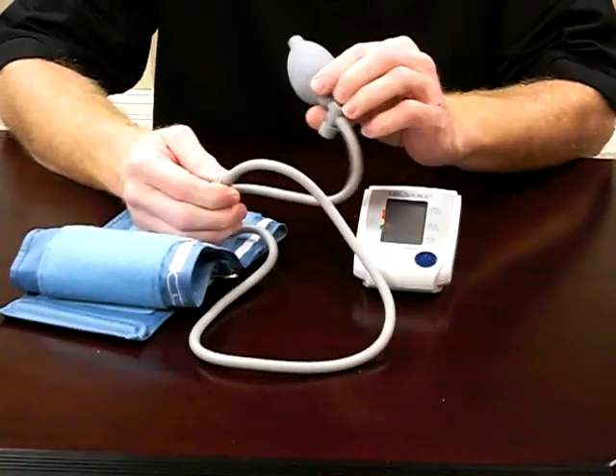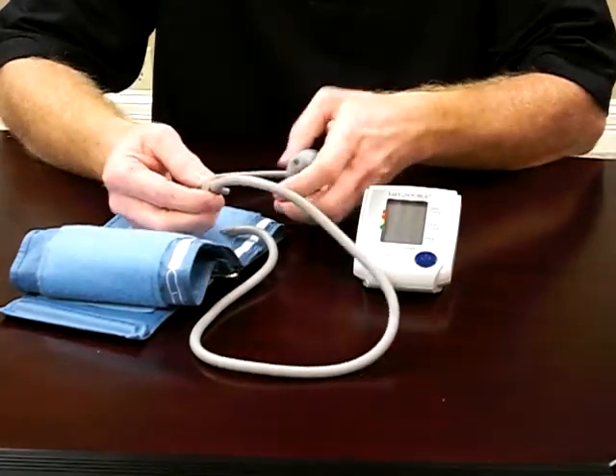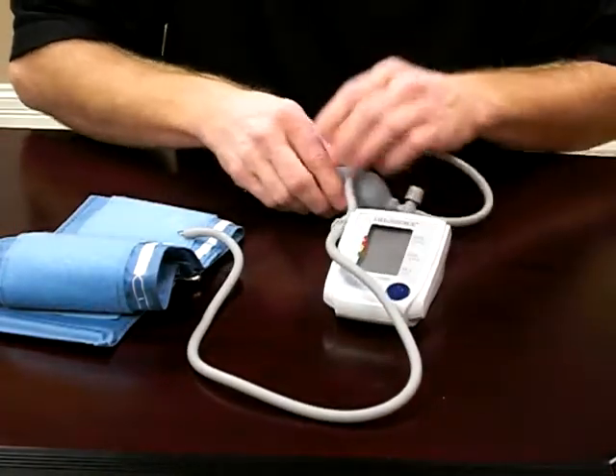Some units have a bulb because you have to pump them up. Some units are automatic, but they plug in the same. Plug it in the side, and that part is ready to go.